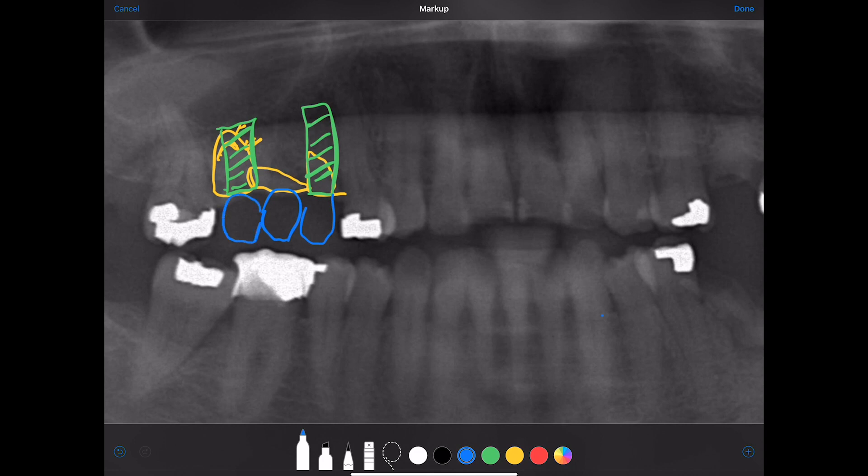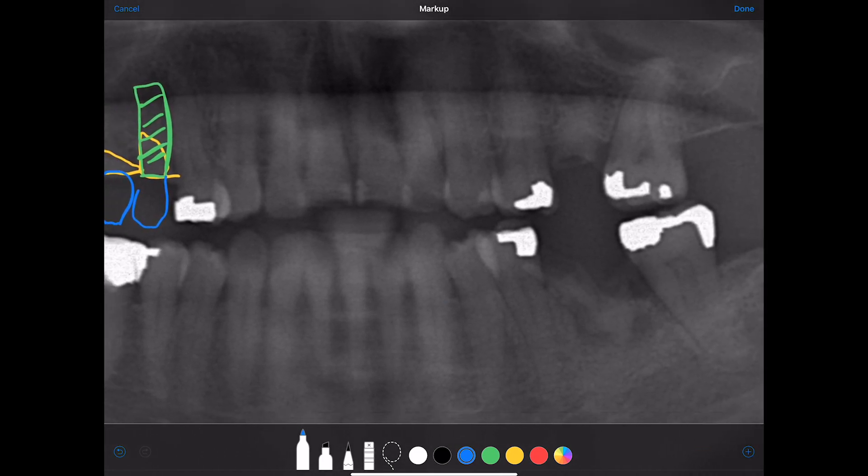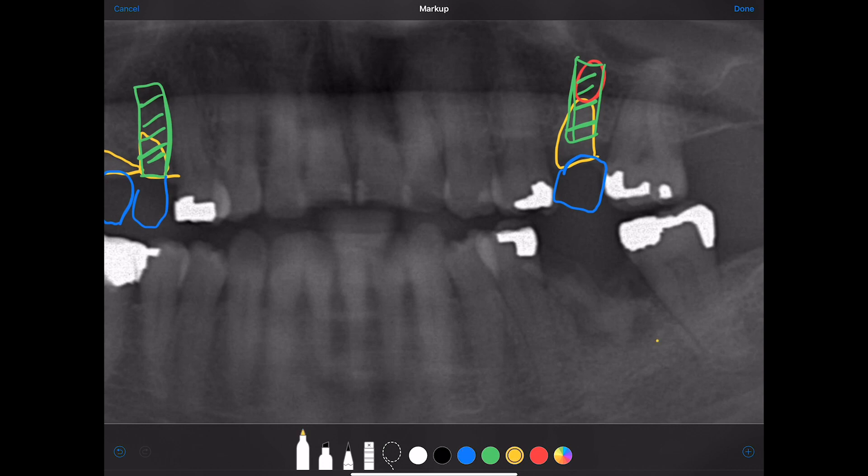On the other side we have another root tip right here, and it looks like we definitely have some bone to engage with the apical portion of our implant and put a nice little crown on there. Down below there are also some retained roots, as you saw in the clinical photos.